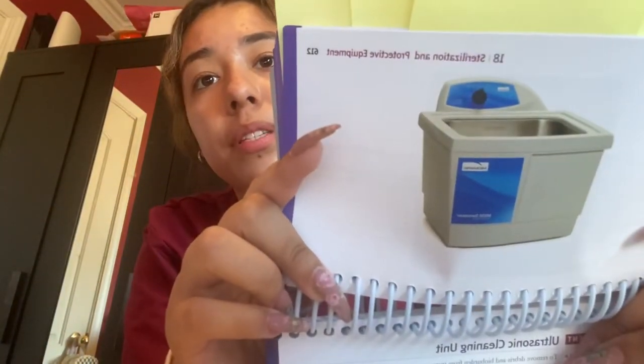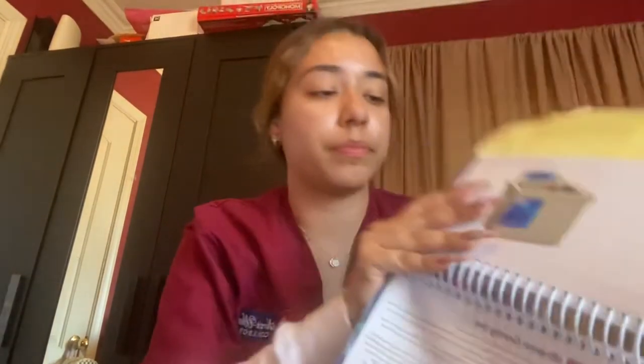The ultrasonic cleaner looks like this. It removes debris and bio-burden particles. There's a little lid on the ultrasonic cleaner — we're going to lift it and make sure that the solution we'll be using to sterilize the instruments is filled to the manufacturer's recommended level.